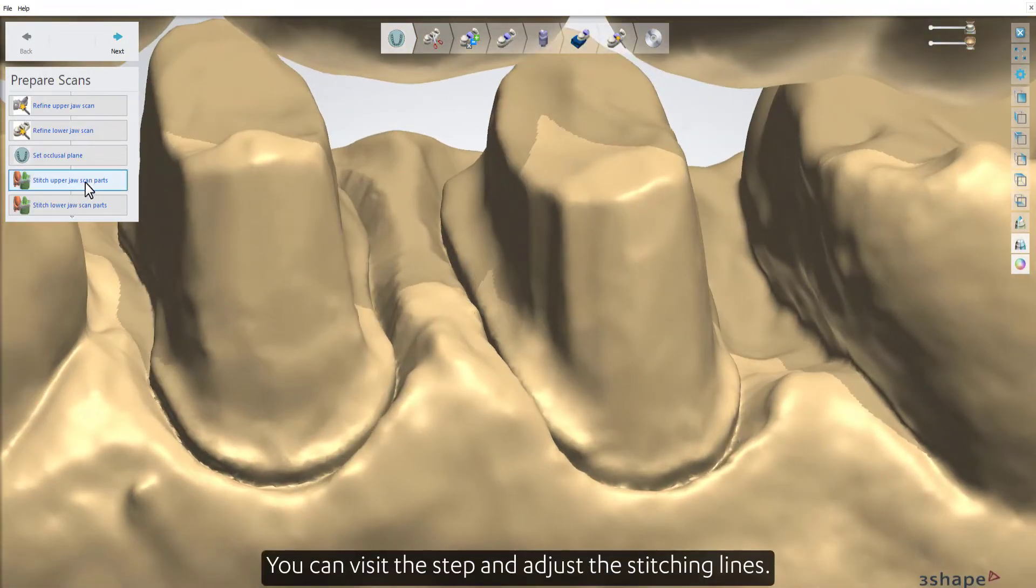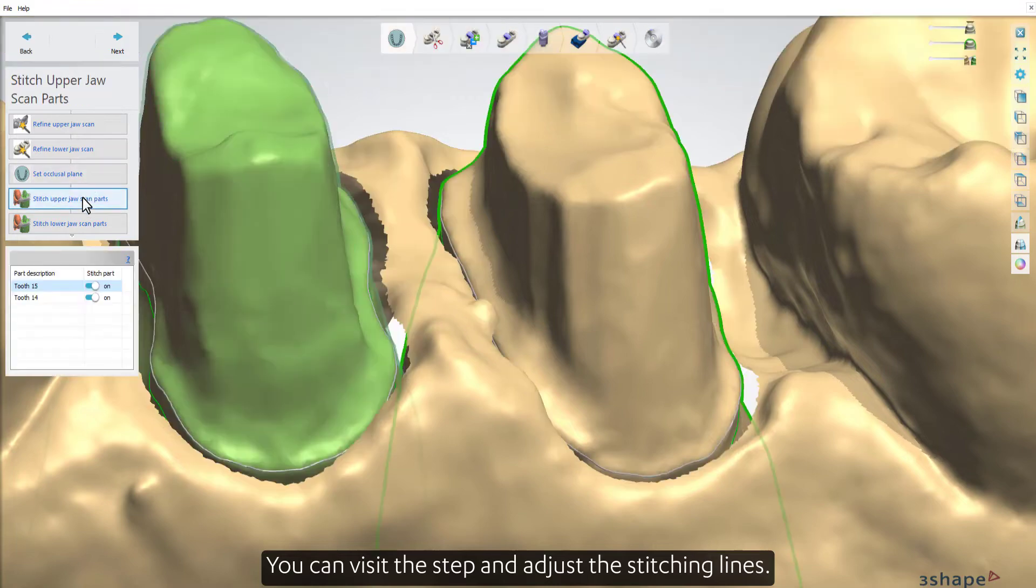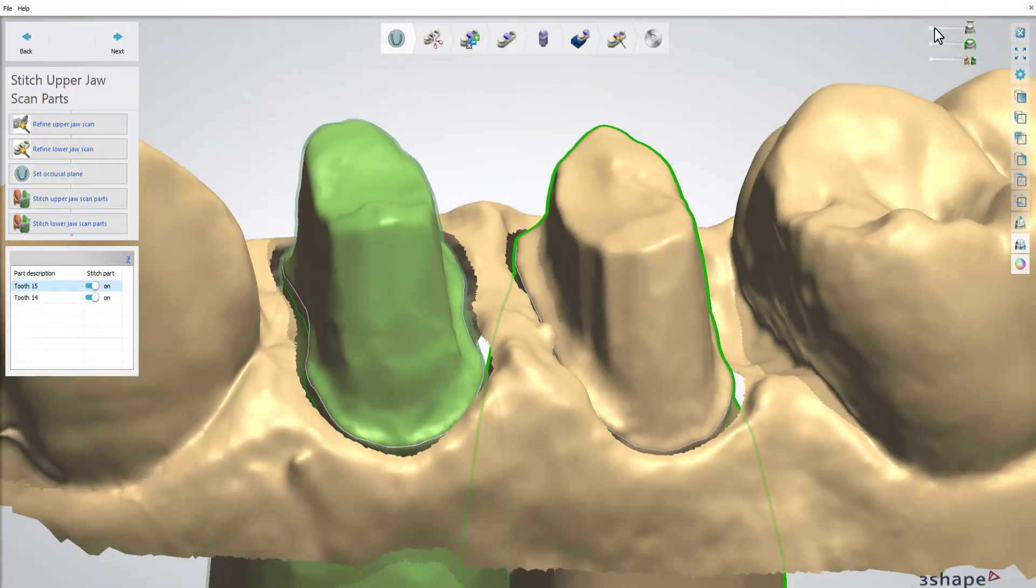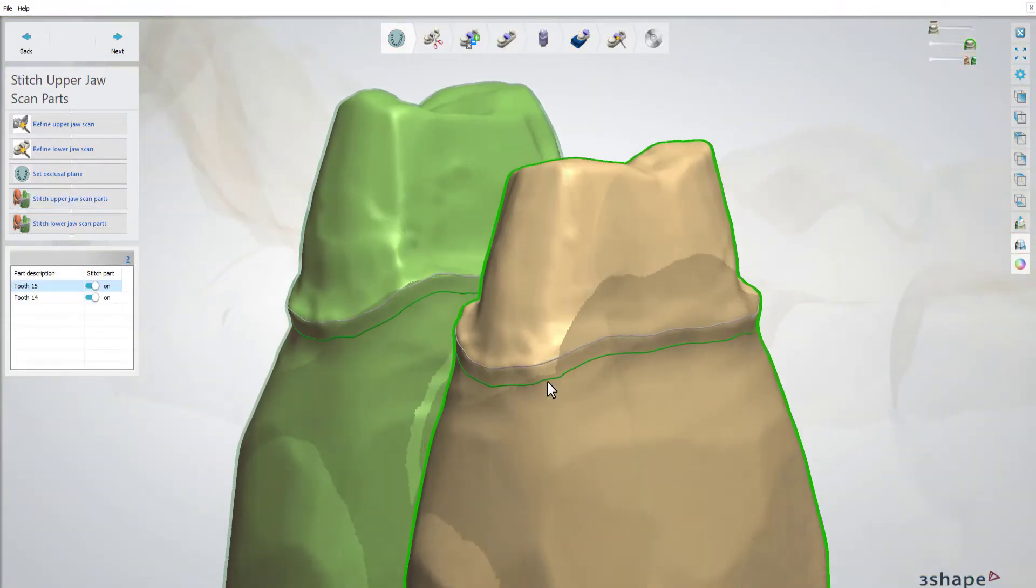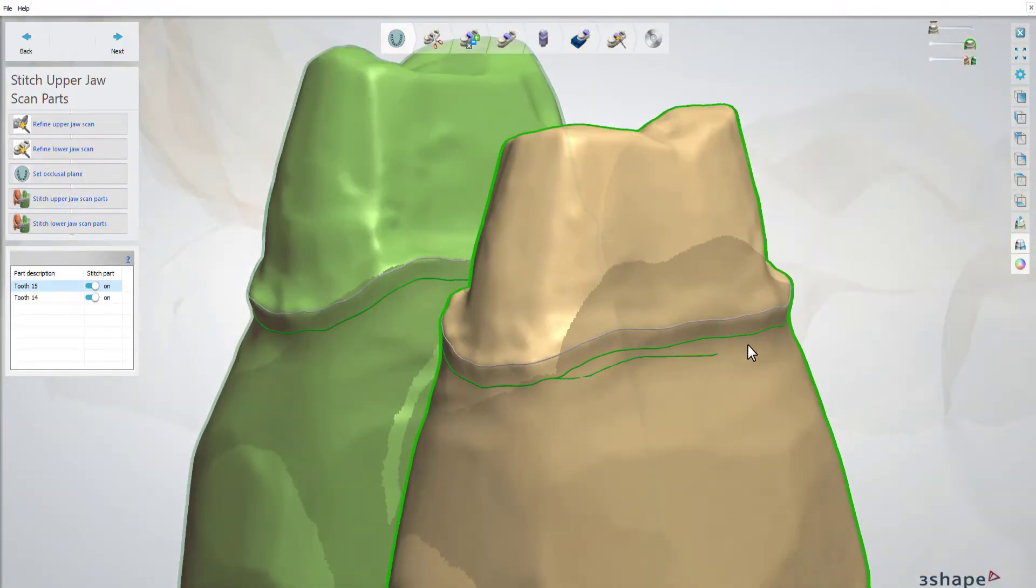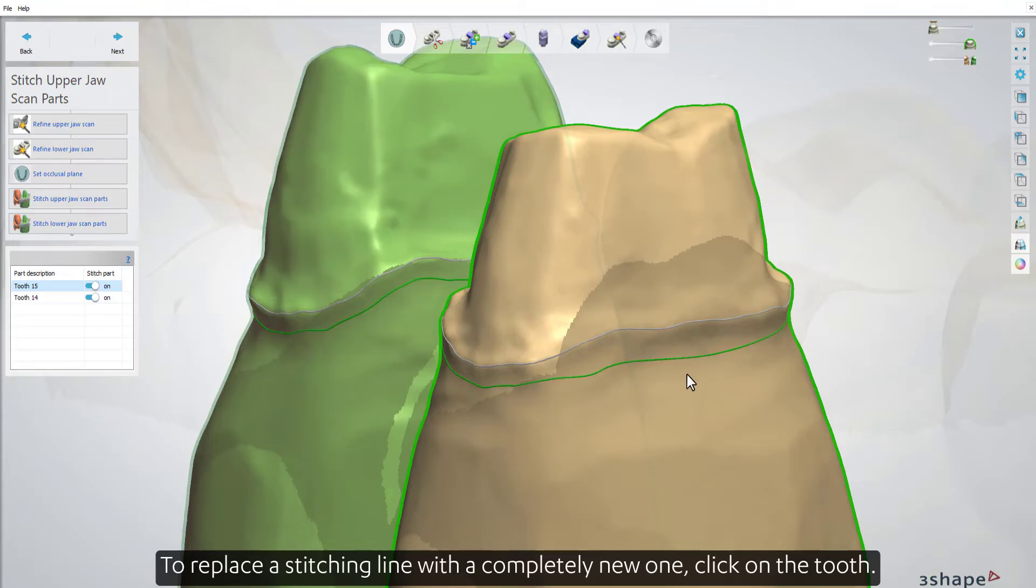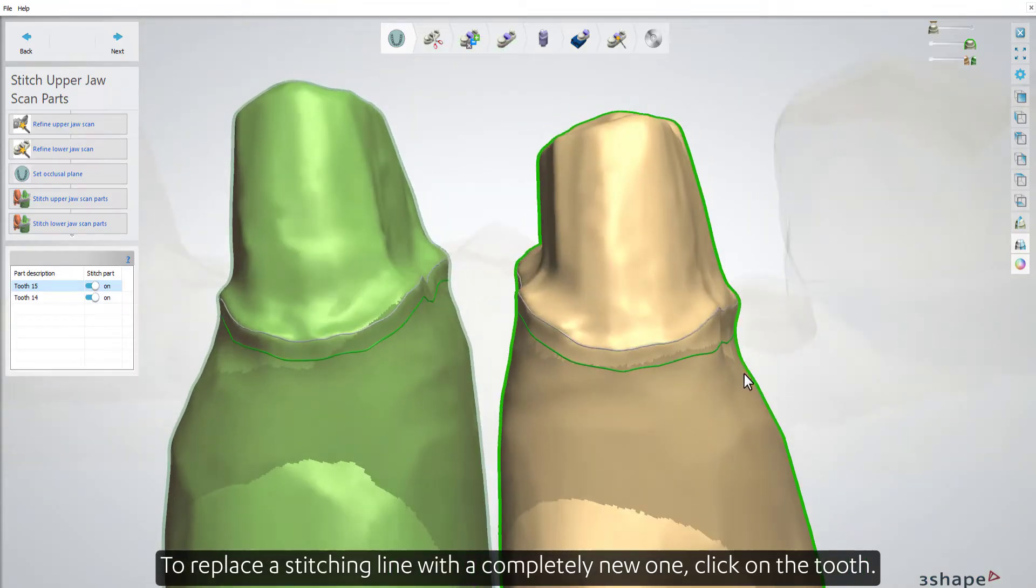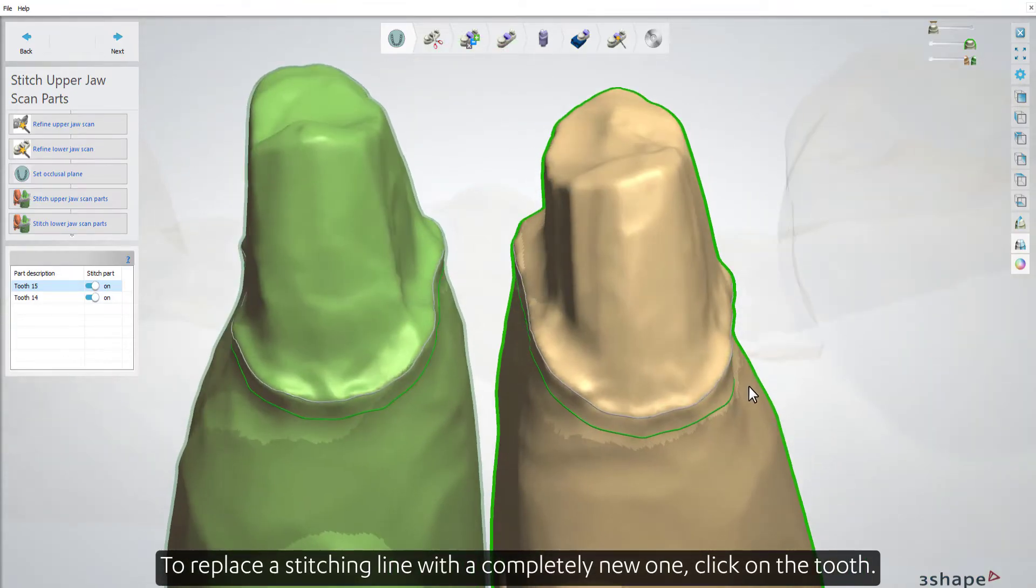You can visit the step and adjust the stitching lines. To replace a stitching line with a completely new one, click on the tooth.